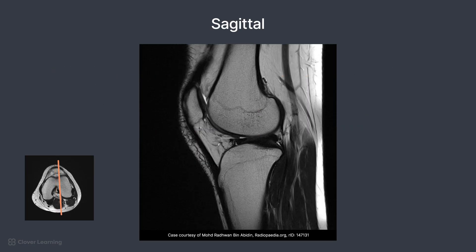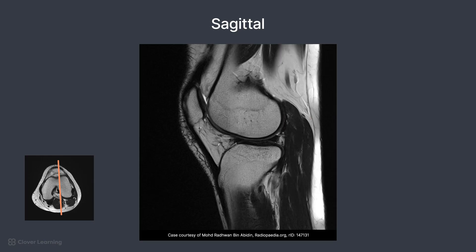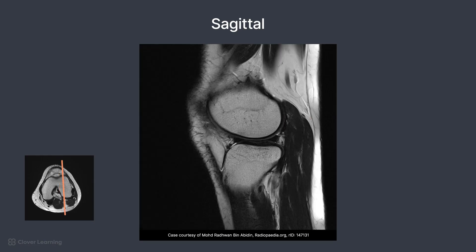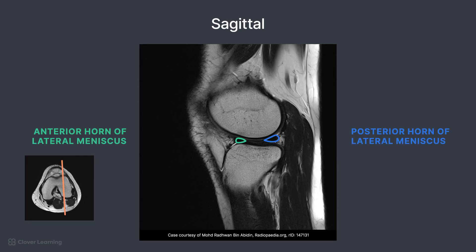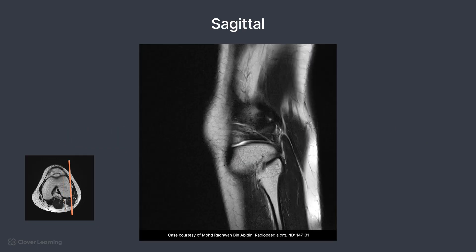As the slices continue laterally, the lateral condyle emerges. Again, the meniscus is demonstrated here — this time it is the anterior and posterior horn of the lateral meniscus. On this final slice, the head of the fibula is seen, confirming this is the lateral side of the knee.